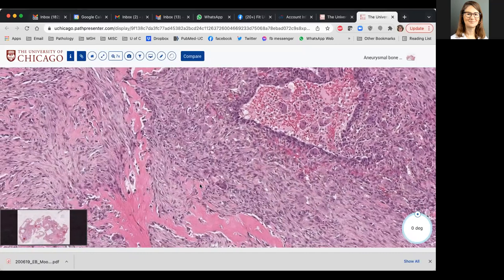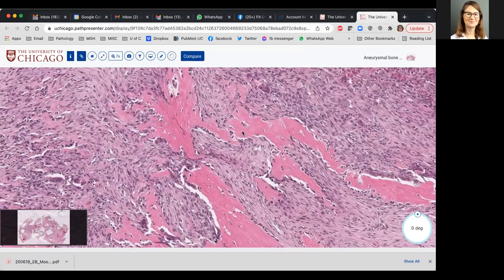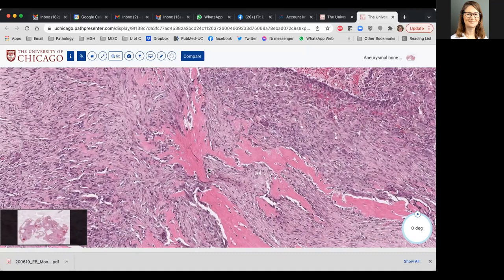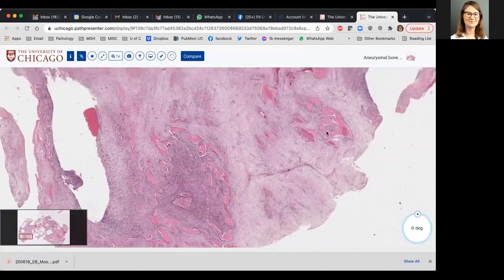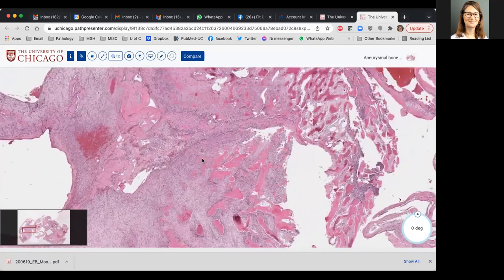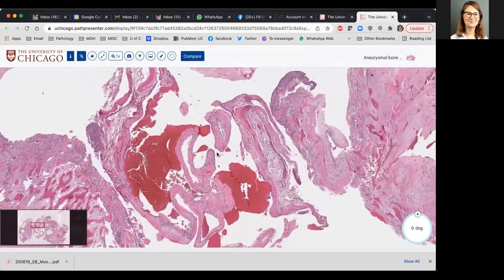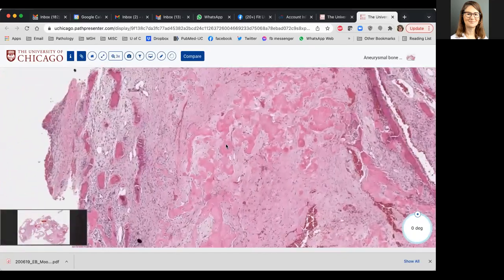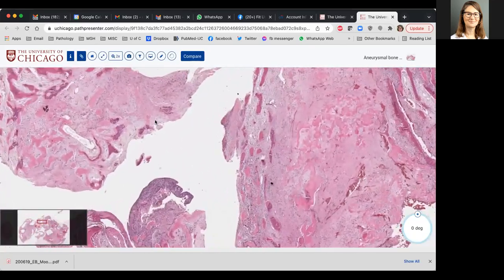That's very characteristic. You can have woven bone. So here you see nice bone. In this case, it has osteoblast rimming, so we can regard that as likely reactive or benign bone. But you can see osteoid. You can sometimes see that characteristic so-called blue bone, which we just had in a case, where the osteoid that gets deposited takes on an extremely unusual blue.